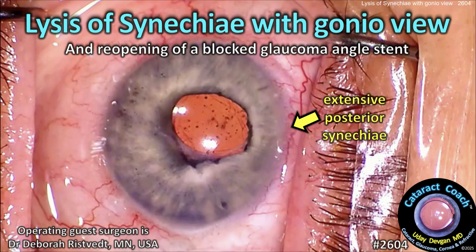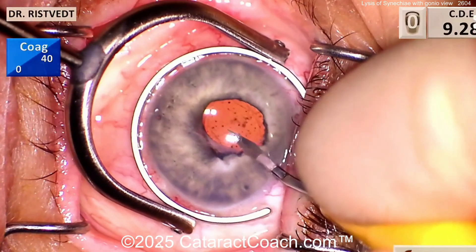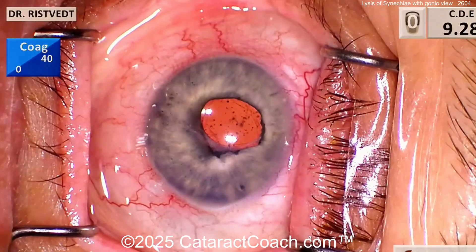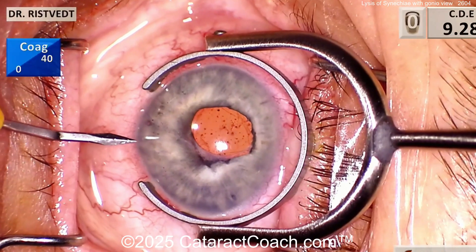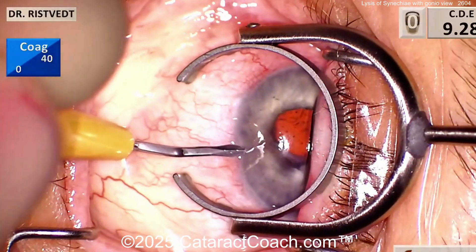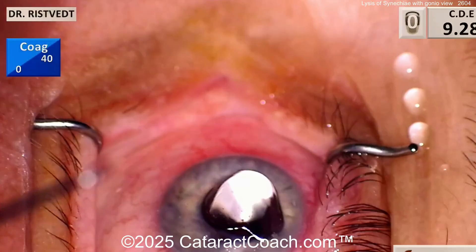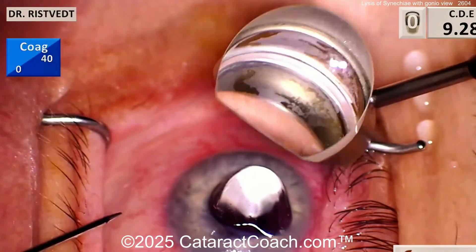CataractCoach.com - lysis of synechiae with a gonioscopic view and reopening of that blocked glaucoma angle stent. Starting off here, things look a little unusual: you've got the iris in the bag, an iris that looks kind of billowy. Maybe there's some weird anatomy here, with a couple of paracenteses going in.